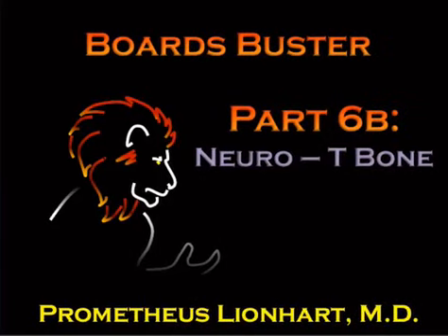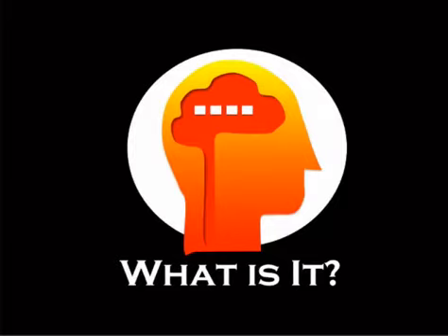Okay, so our next talk is going to be the temporal bone talk, and I'm going to hopefully demystify the major topics here for you. I know that temporal bone is very scary to a lot of people. It's not well understood, mainly because it's not taught well. So I'm going to fix that. So let's go on with our first case here.